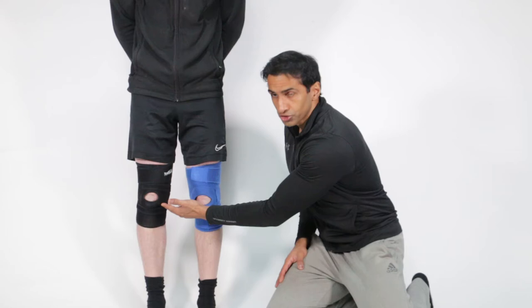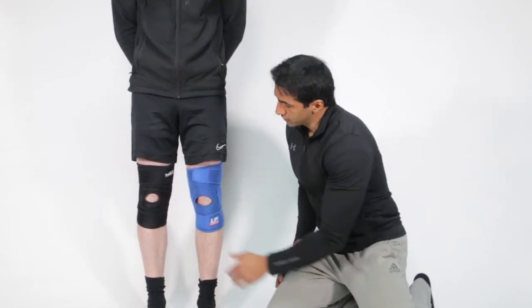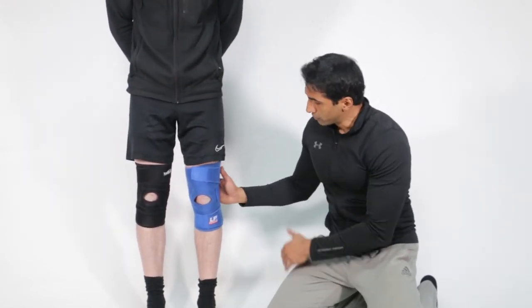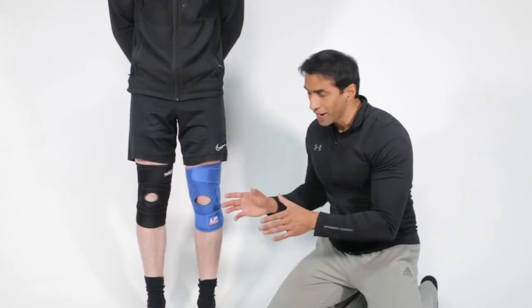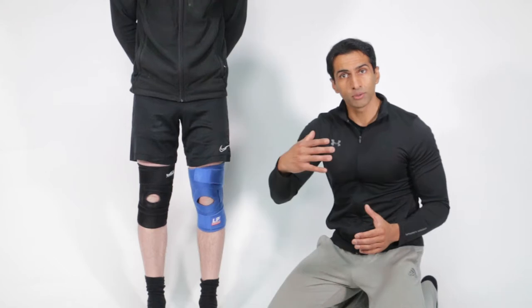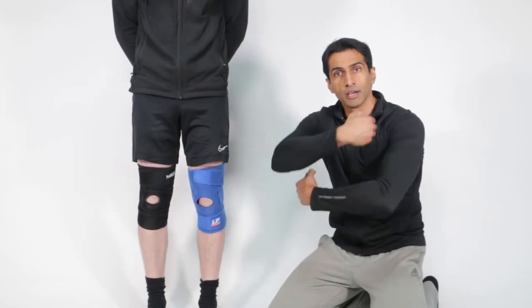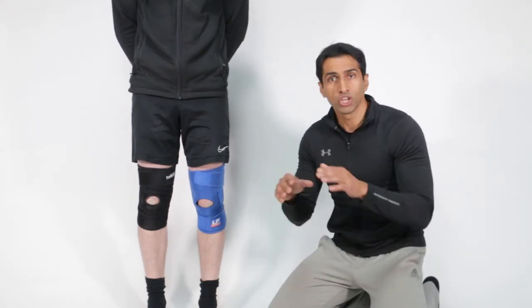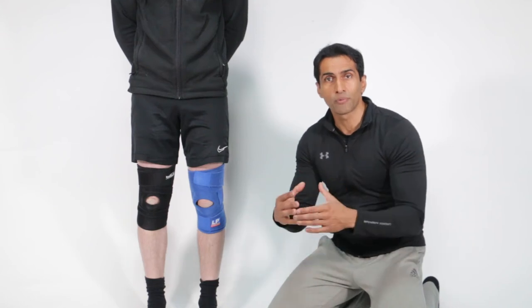We have the four-strap system here on the right hand side by Exos Body Gear, and we have a typical well-known three-strap on the left hand knee. The way the four-strap system works is through cross-torsion — you've got medial and lateral forces coming together, hugging the knee from both angles. It creates almost like a buttress effect, which is a much stronger way of staying in place, and because of that it provides a 360-degree wraparound support.